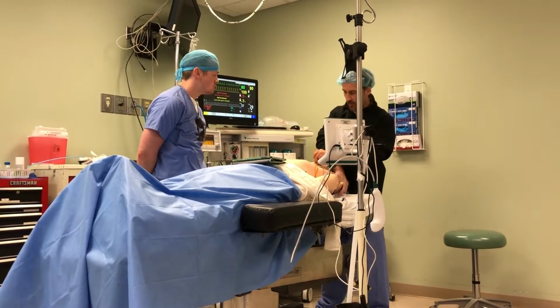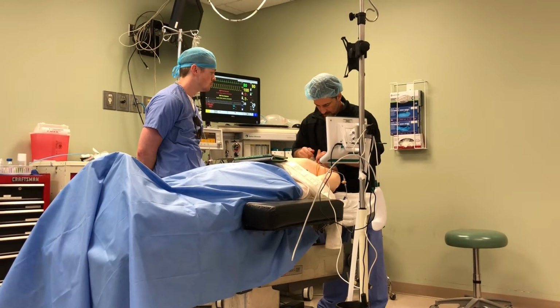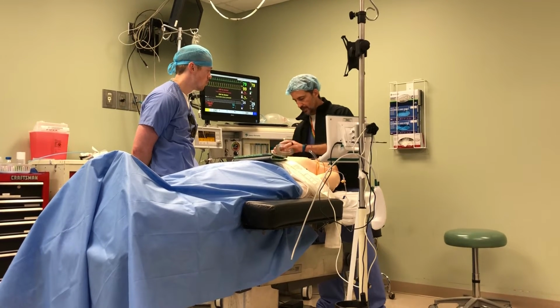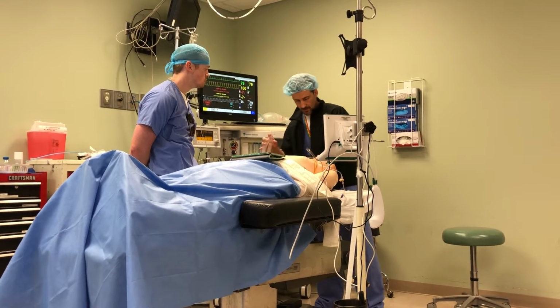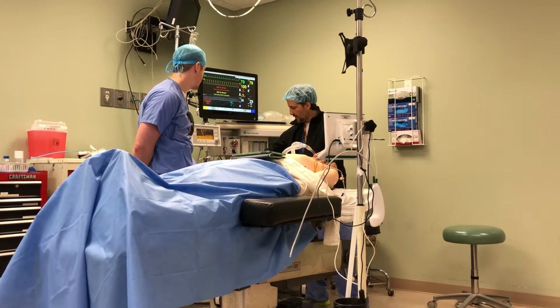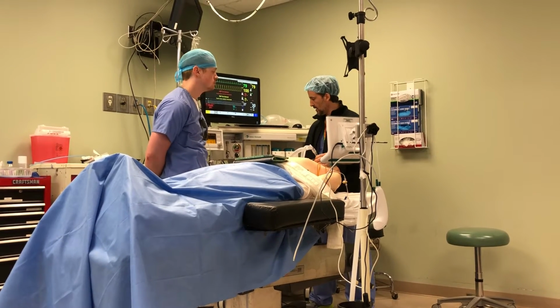So notice with this, there's no paralytic given. It's just lidocaine and propofol. And it'll be pretty difficult to get a good seal on this guy. But we'll pretend that we do. So I got it in there. Got it connected. I'm going to close my APL valve. And I'm going to give him breaths. And we'll pretend that he's getting good breaths.